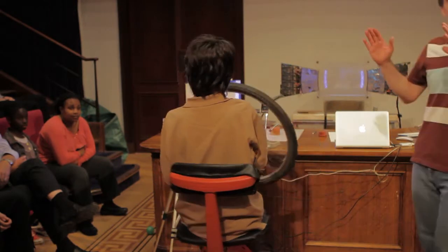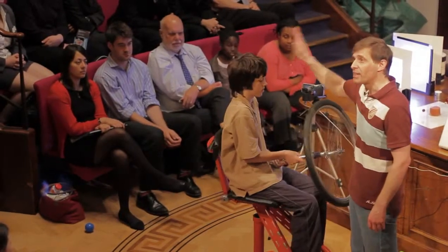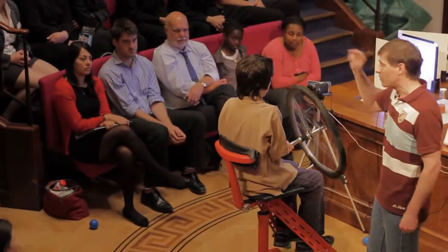So if I was trying to knock over this spinning wheel, I'd have to wait until it came round, and I'd have to give it a knock. And then I'd have to wait till it came around again, and I'd have to give it another knock. In fact, I'd have to keep knocking at just the rate it likes to be hit at. And that's called matching its resonant frequency.